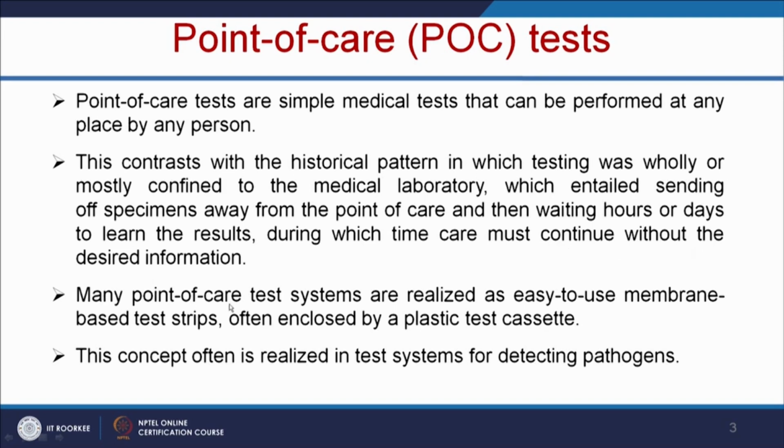So most of the point of care systems are based on the principle of easy to use membrane based test strips, and these are mainly useful for rapid detection of pathogens.